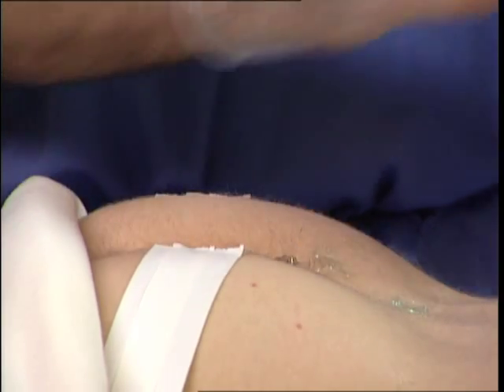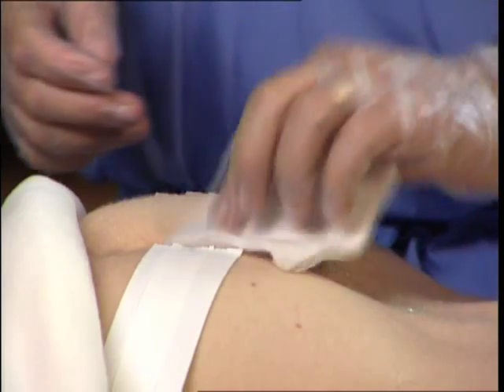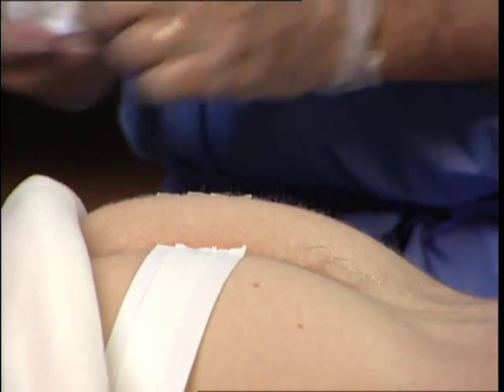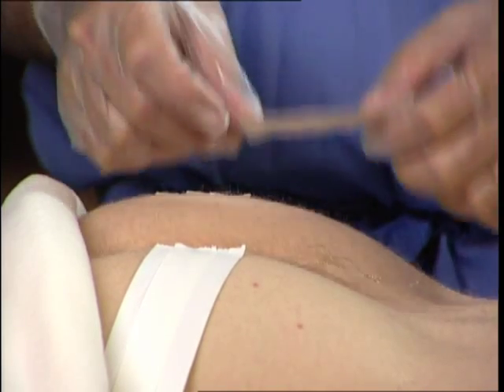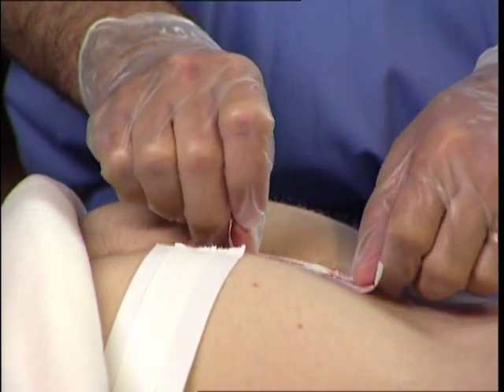Once the injectate is done and the image is recorded as necessary for the medical record, the probe is removed, the needles are removed, the area is cleaned, and then a band-aid is placed over the wound. And thus, this concludes a successfully placed caudal epidural steroid injection.